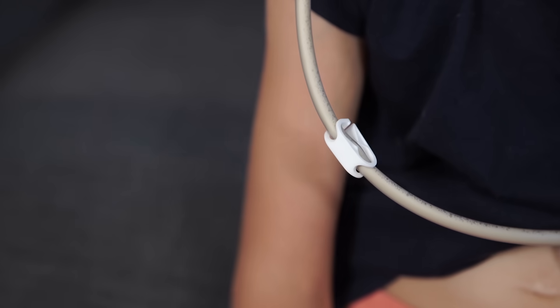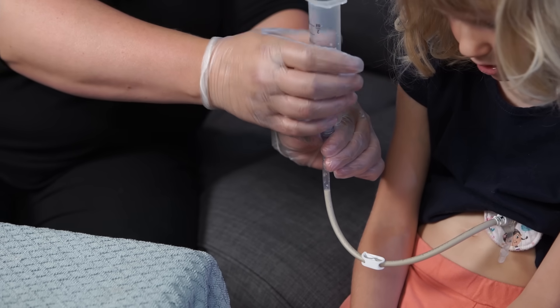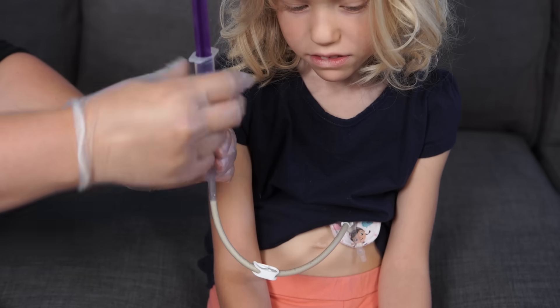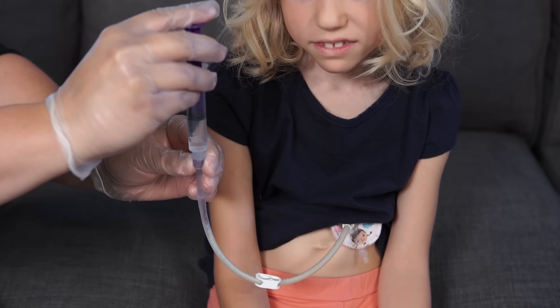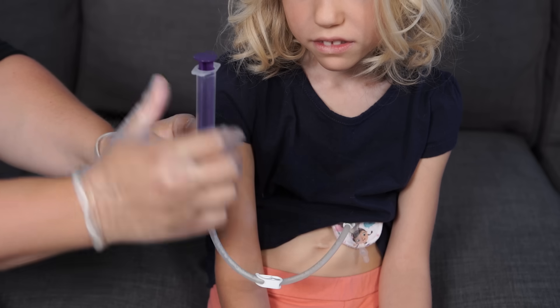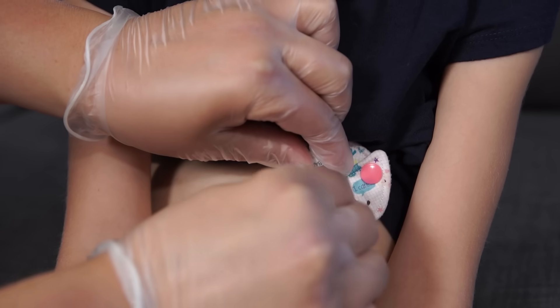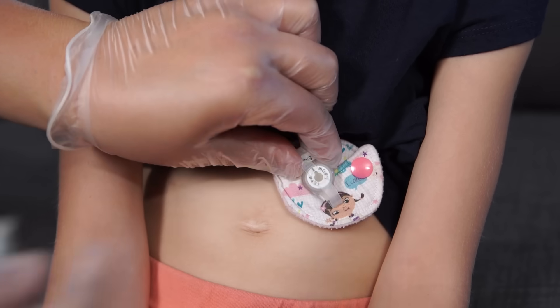Close the clamp on the feeding tube or extension. Remove the syringe from the feeding tube. Flush the feeding tube with the prescribed amount of water. If you are using a low-profile feeding tube, disconnect the extension from the feeding tube.